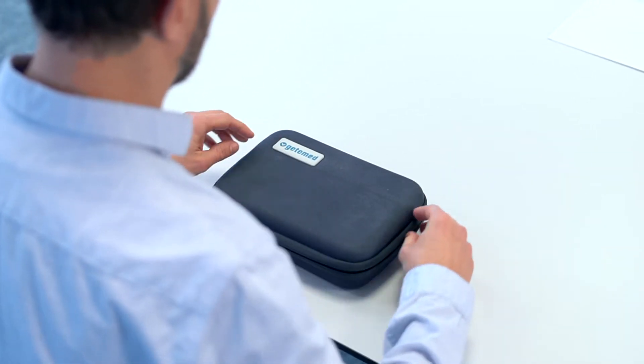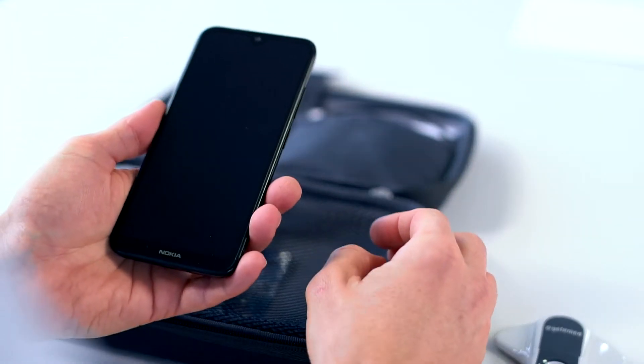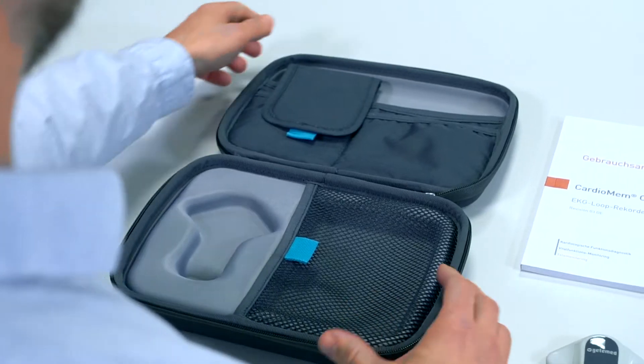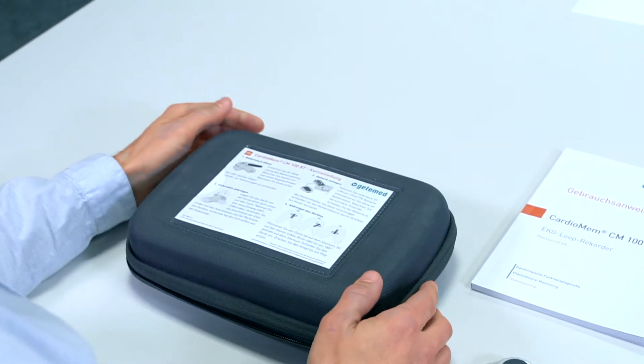The CM100XT kit comes in this case, which contains the recorder, the smartphone with its charging cable, a battery, and the instructions for use. Brief instructions on how to use the recorder are given on the back.